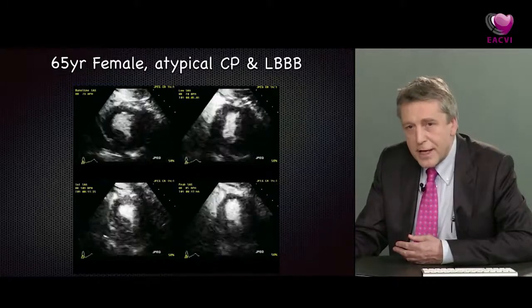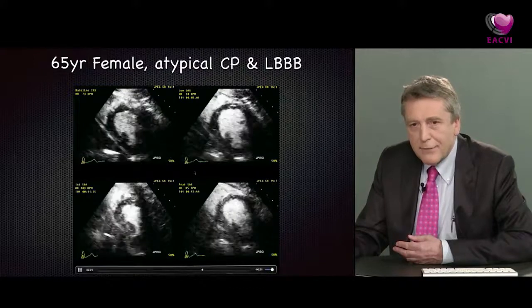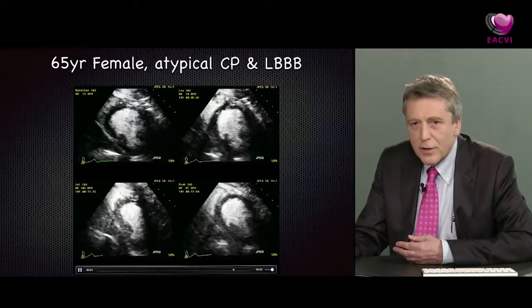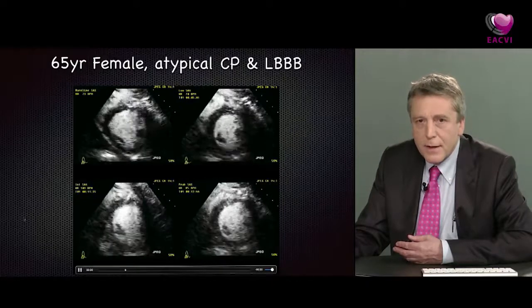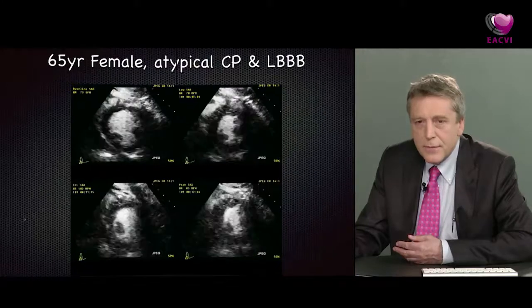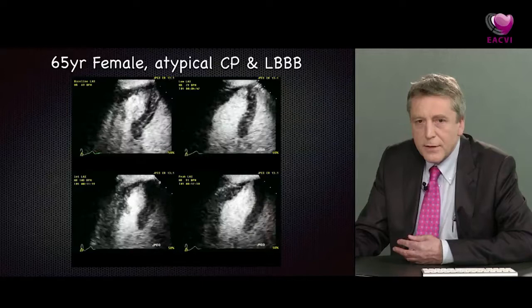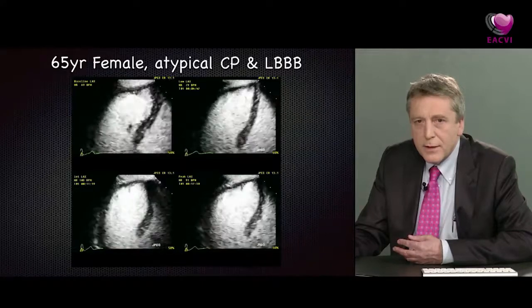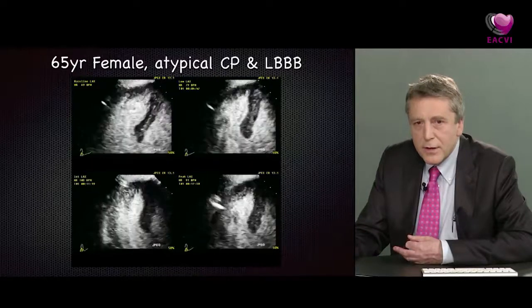So the format's the same. Baseline at the top, peak stress down here. Have a look at this and see what you make of it. Here's the short axis view. This is the three-chamber view. I'll leave that playing for a few minutes. Here's the two-chamber view.